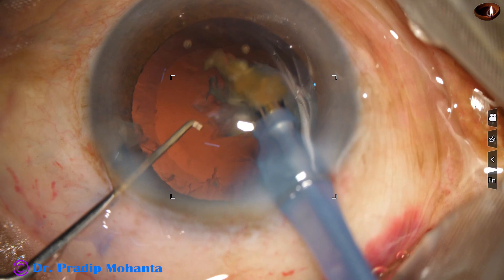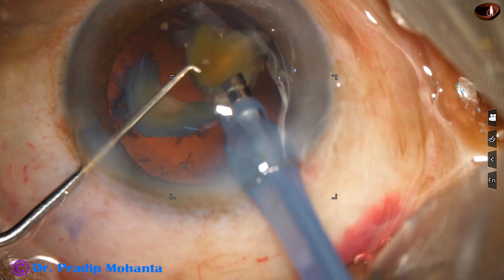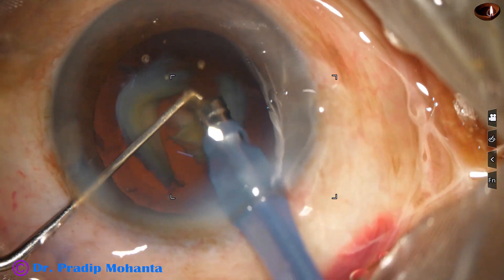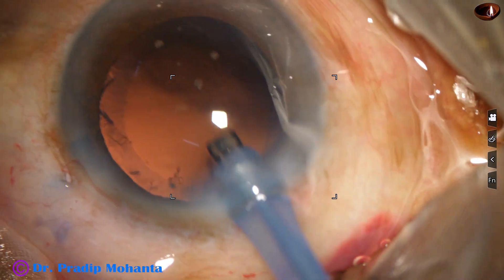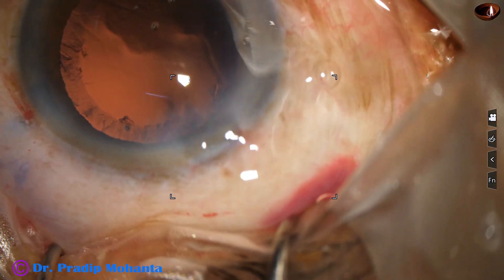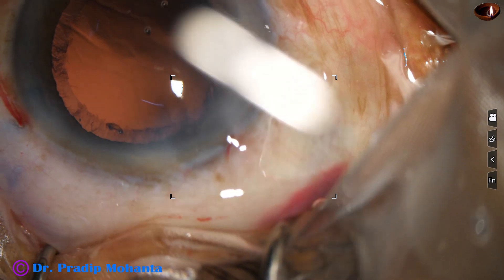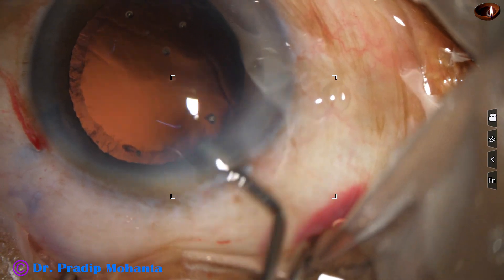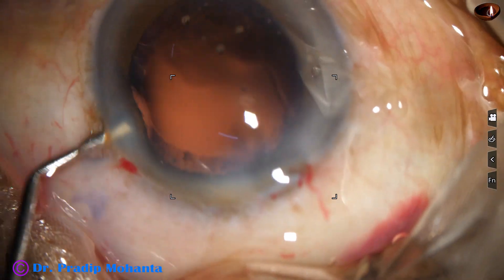The chance of catching the posterior capsule in such cases is very high. So during emulsification of the last small pieces, we can decrease the parameters and do it slowly. We have to see that the anterior chamber is very stable. We can even do the viscoelastic scaffold technique to emulsify the last piece.